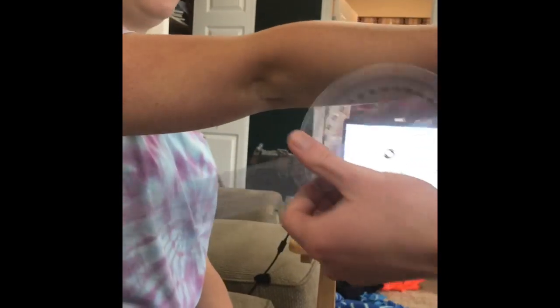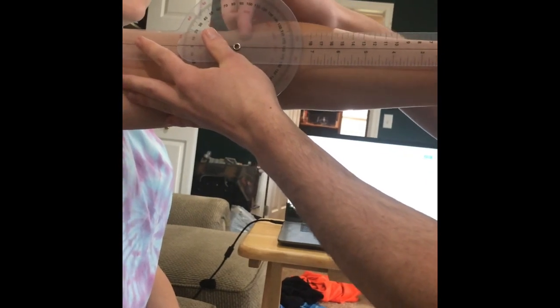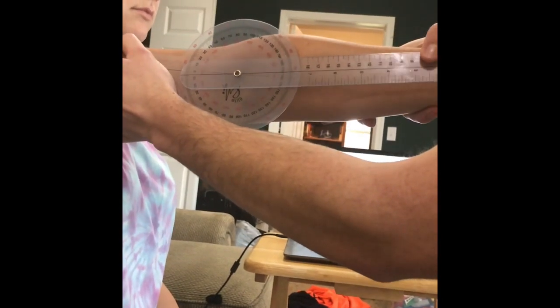All right, so now we're going to be measuring the hyperextension of the elbow joint. So you're going to have your patient bring their arm out into a horizontal movement. Make sure that the axis of rotation is right on your elbow joint and your stationary arm is even with your humerus. And then your movement arm is going to be lining up with your radius and or your ulna.